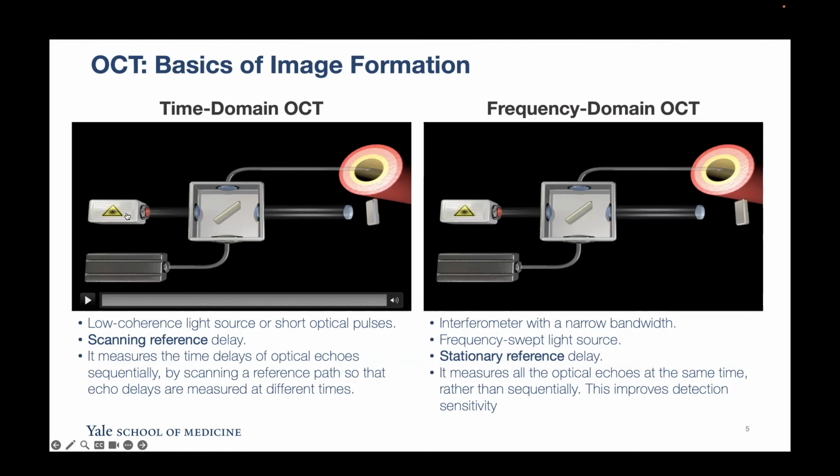This is a laser source, and this is the time delay, in time domain OCT, which generated pulses of low coherence light. The interferometer here breaks the pulse into two halves. One goes to the coronary, which is the sample arm, and the other one goes through this path here, which is the reference arm, which is inside the box, the cart that we move in the cath lab.